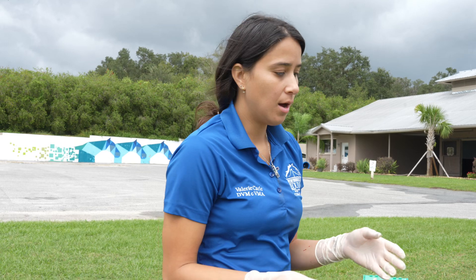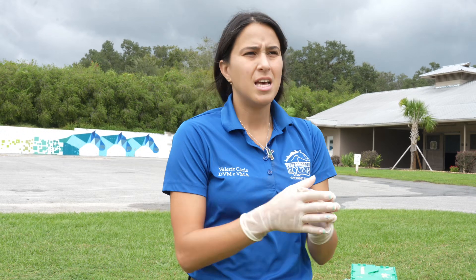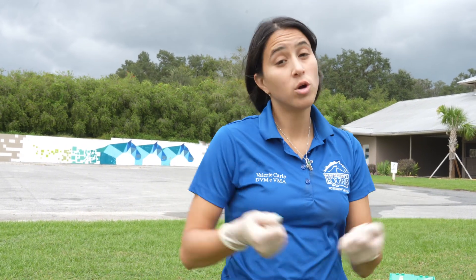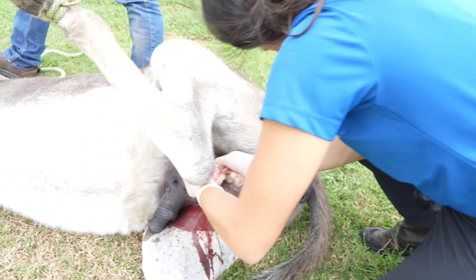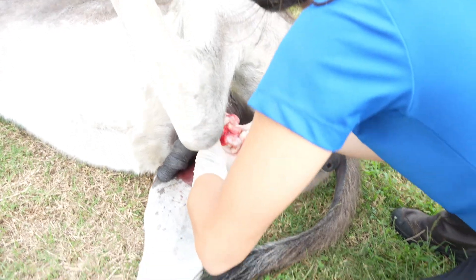The older the equid is, the more time we have to leave the emasculator on. The reason we place it and leave it there is so that it crushes correctly and the vessels don't start bleeding when we release it. The older the patient, the more time the emasculator needs to stay on, which means more anesthesia time. Ideally we do them younger, around two to four years old. This one was for behavior issues, and when those testosterone levels decrease it's definitely going to calm them down.